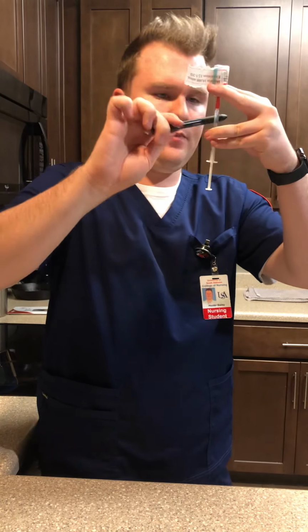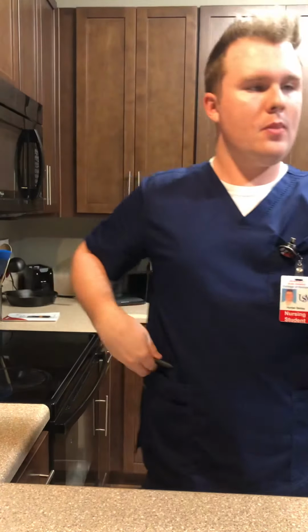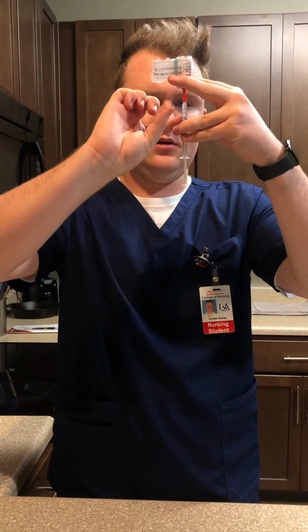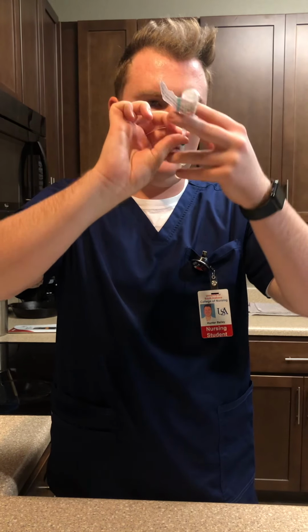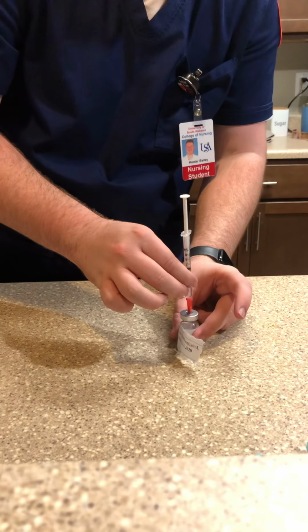A piece of the plastic was starting to come off. Okay, so now that the air bubbles are gone, I'm going to make sure that I have the correct dose, which is half a milliliter. I'm going to turn it over and remove.